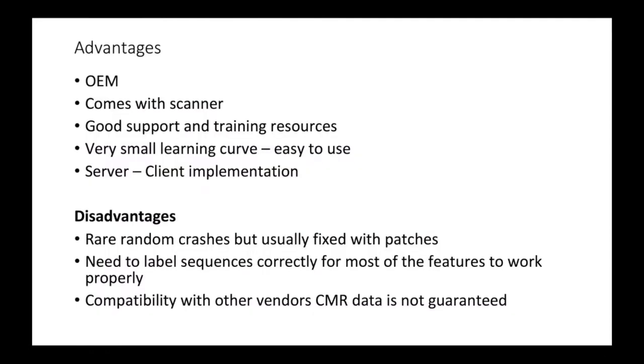What are the advantages of this OEM supplied software? First of all, they come at a cheaper cost because the cost is included with the scanner most of the times. With a very marginal amount, we can get a very good package. We have a good support system in the form of application specialists who are there to train us, to teach us how to use the software properly, which is very important. That's the reason why they are very easy to learn and easy to use. And most of these have server client implementation in the case of very large radiology departments, where it becomes very important.